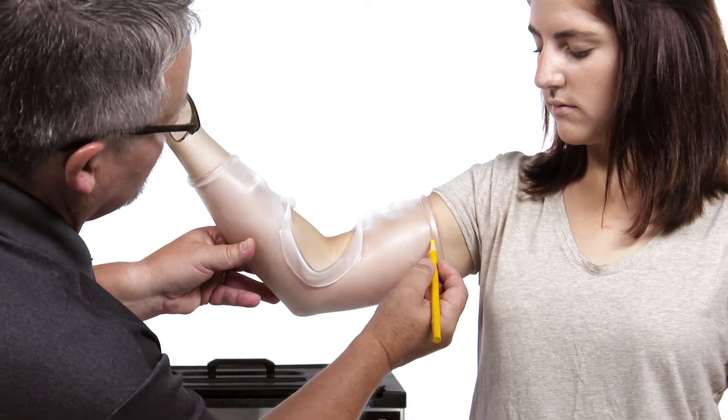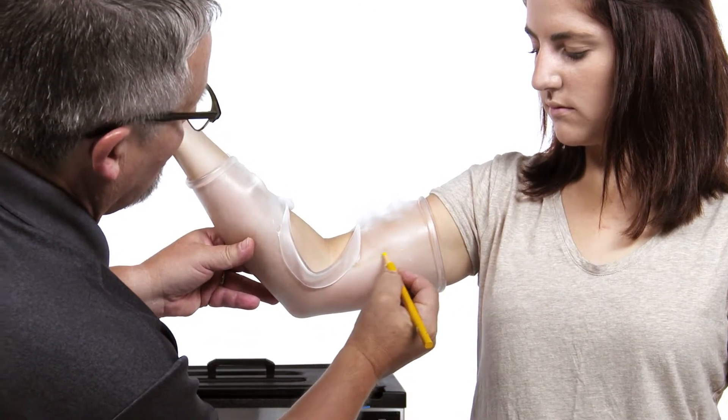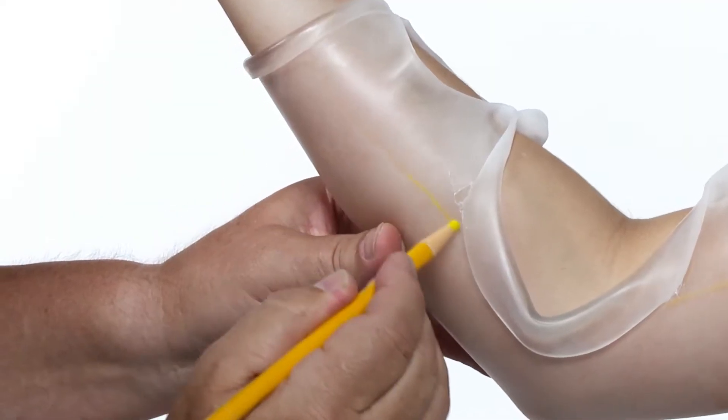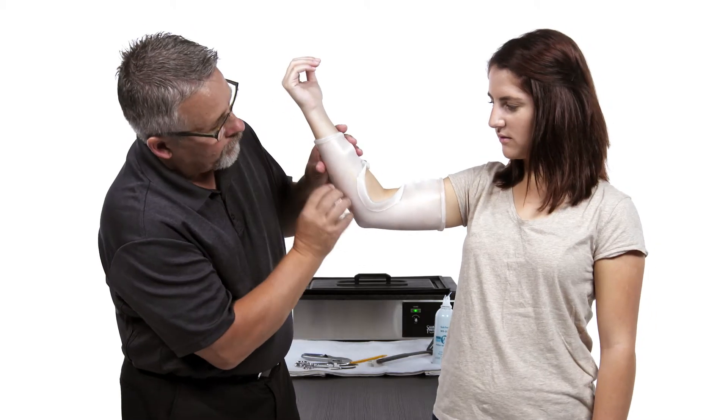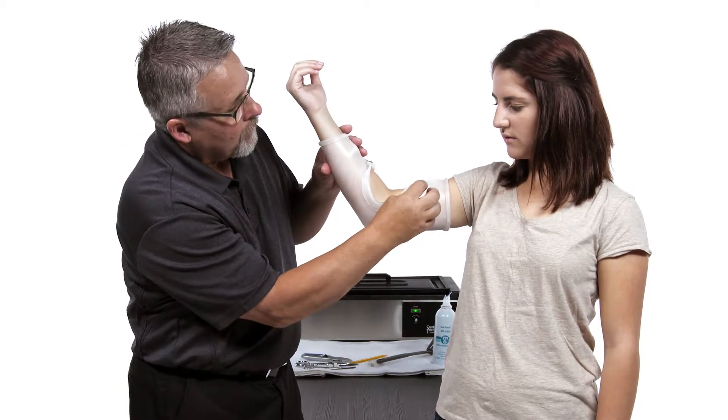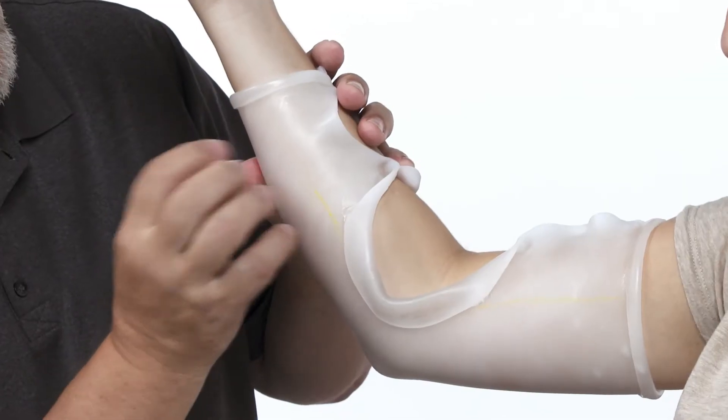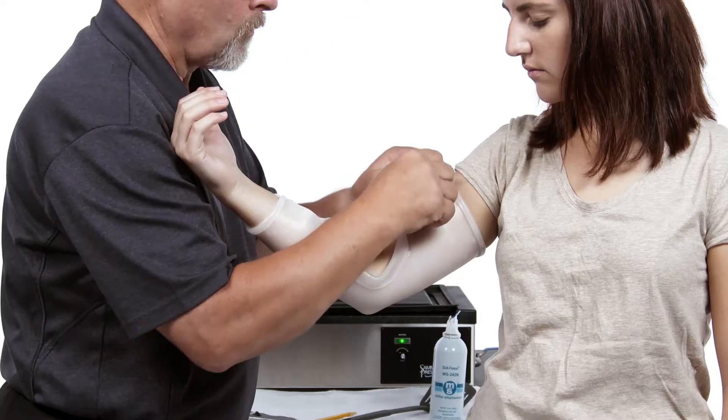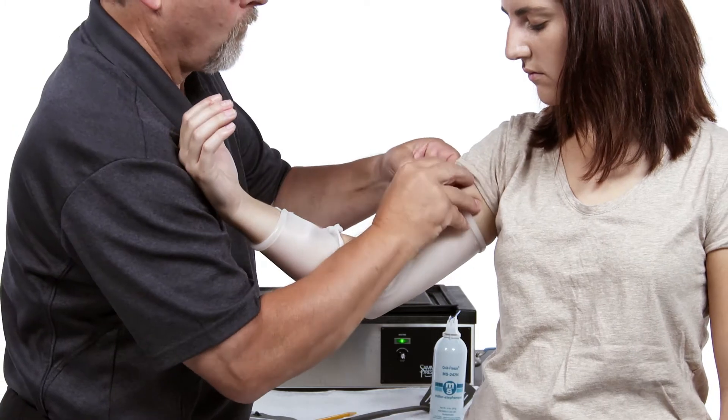Mark your trim lines. This is typically a semi-circumferential measurement. If the orthotic has cooled enough to remove, it should sound like you're tapping an egg shell with your fingernails. Also, the material will no longer be transparent.